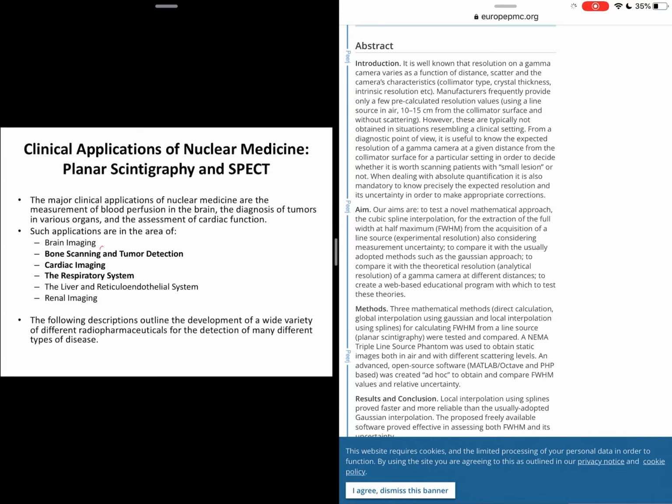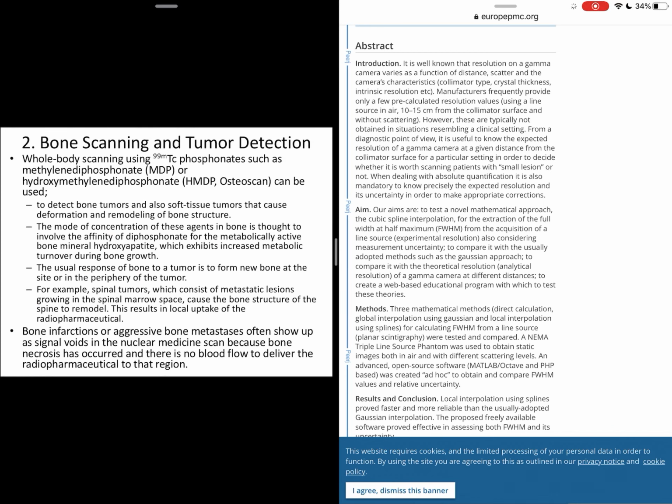Okay, we have a few applications here, for example brain imaging, bone scanning and tumor detection, cardiac imaging, and the respiratory system. For this recorded lecture, I'm going to explain bone scanning and tumor detection only. So you need to do a homework on cardiac imaging and the respiratory system. I will inform you later about this one.